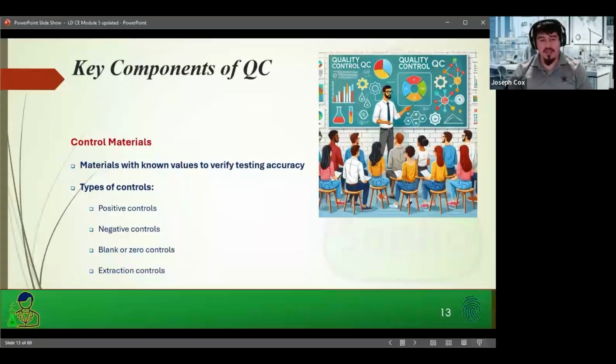Same with toxicology, you can have a hydrolysis QC that you're showing that when you're breaking off the glucuronides of like morphine or codeine, that you're properly knocking off those molecules, and then so your hydrolysis is working, and you're not just getting a negative result because the analyte's not there.